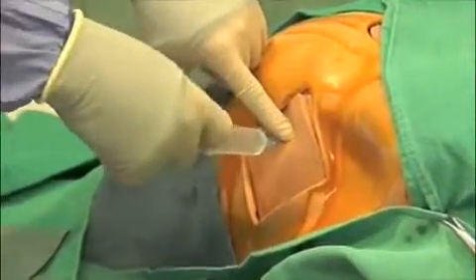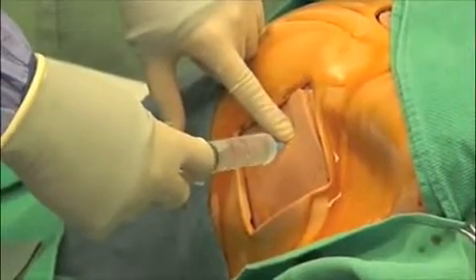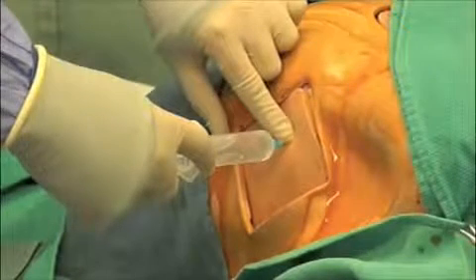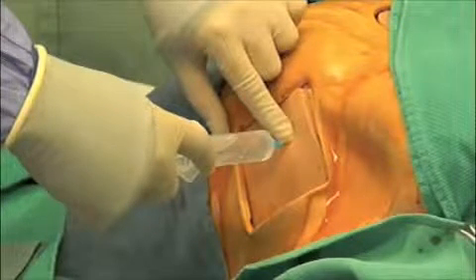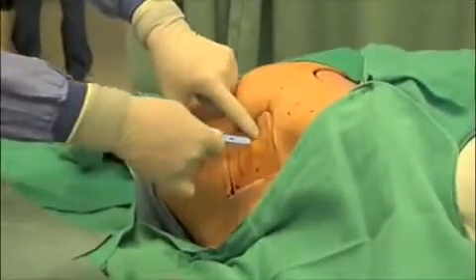Aspirate while advancing needle through subcutaneous tissue. Return of air indicates the parietal pleura has been reached. Inject a bolus of local anesthetic to freeze the pleura. Re-landmark insertion site.